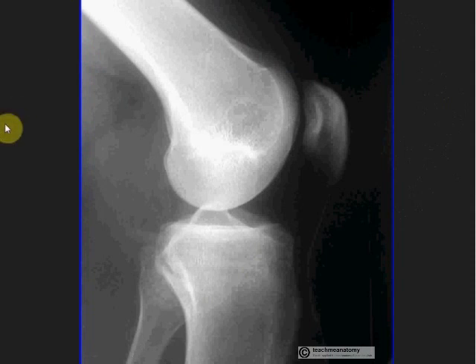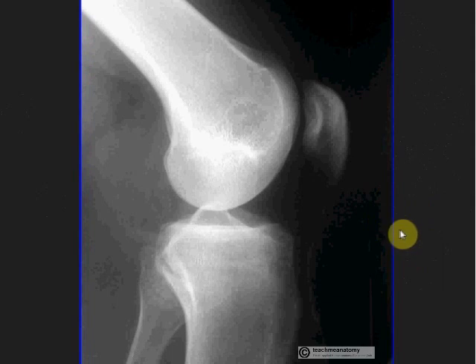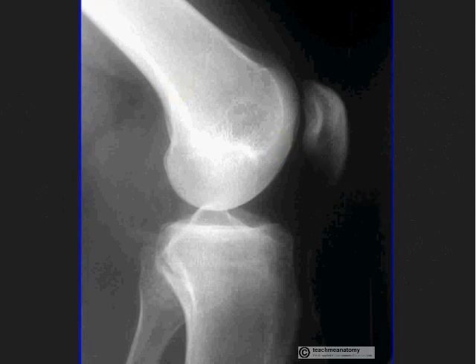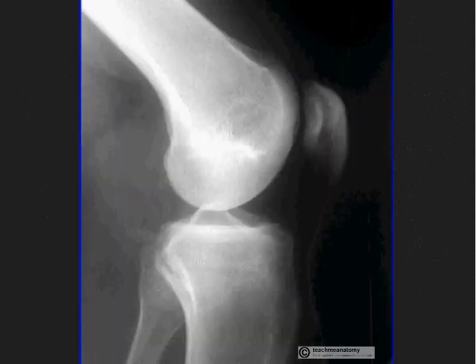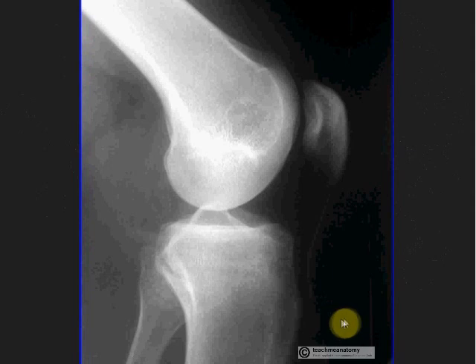Here is a lateral view of a knee. As before, you would appraise its quality after checking the patient's name and the date on the radiograph. Also, you want to make sure that there's a marker on there, so you know it's definitely the right or left limb. So this is the lateral view — again, you could follow around the bony cortex. Real basic stuff at the moment. Look for normal anatomy. At this early stage, you just want to be able to recognise normal anatomy on an X-ray, and I'll run through that in later videos.